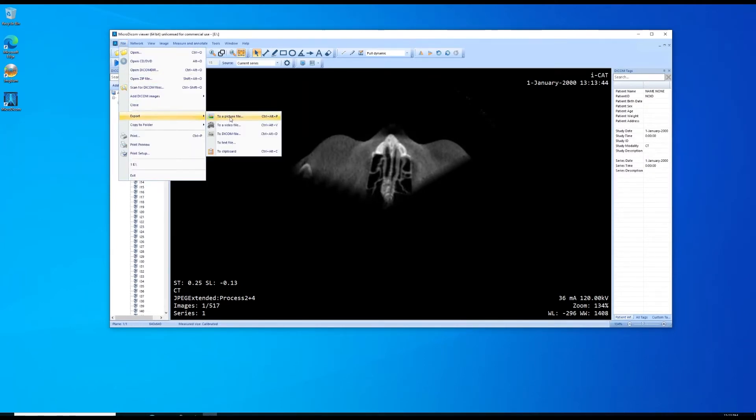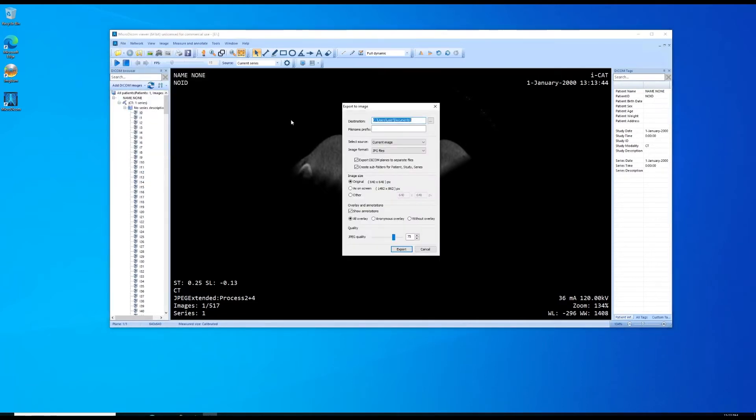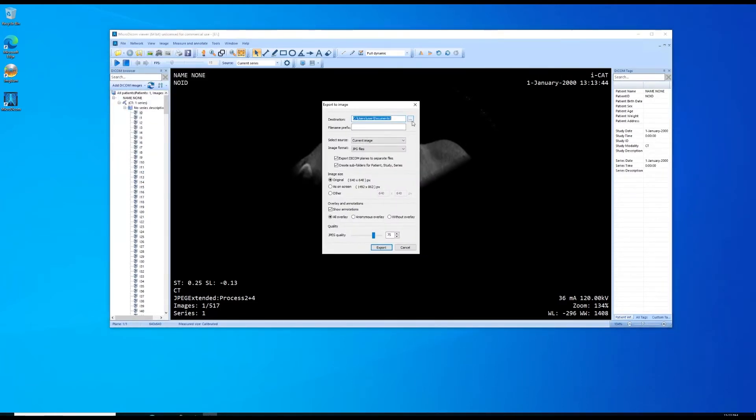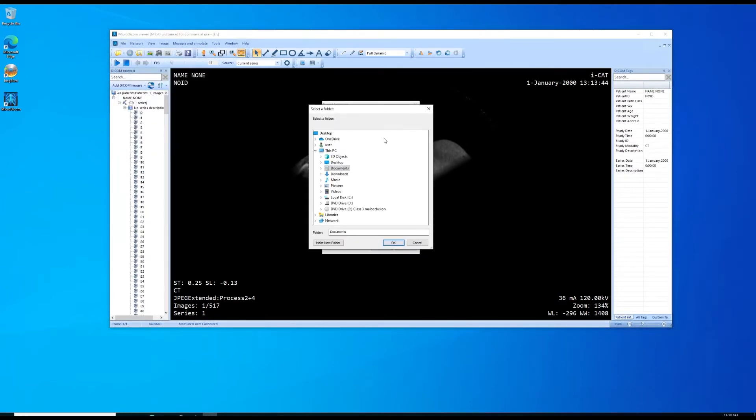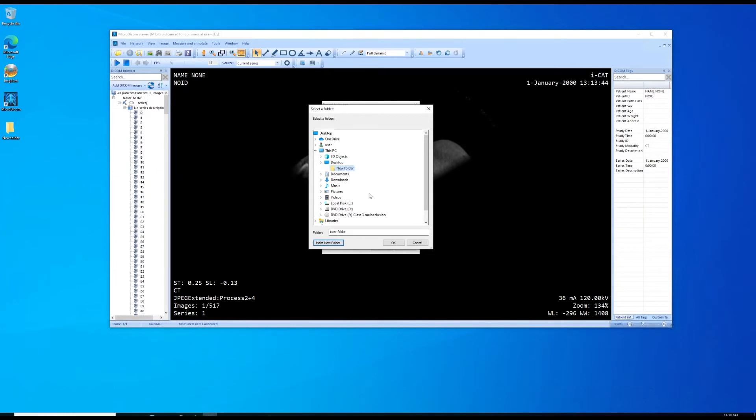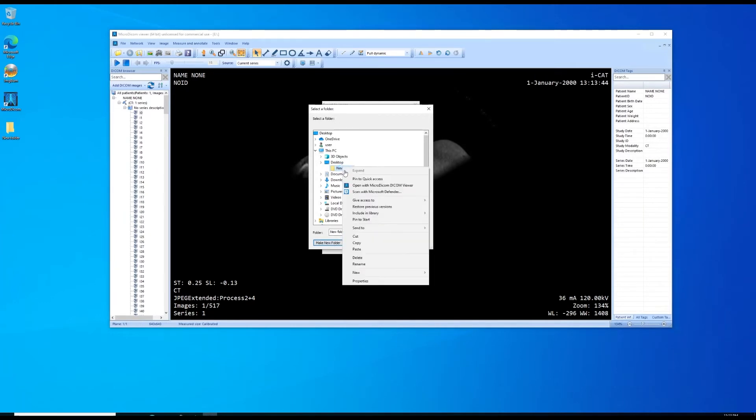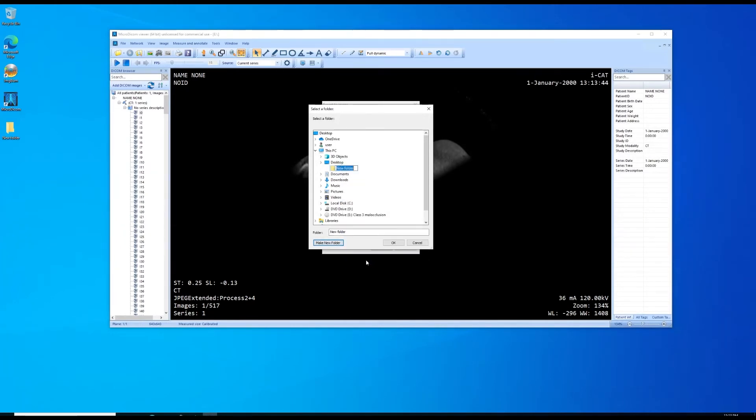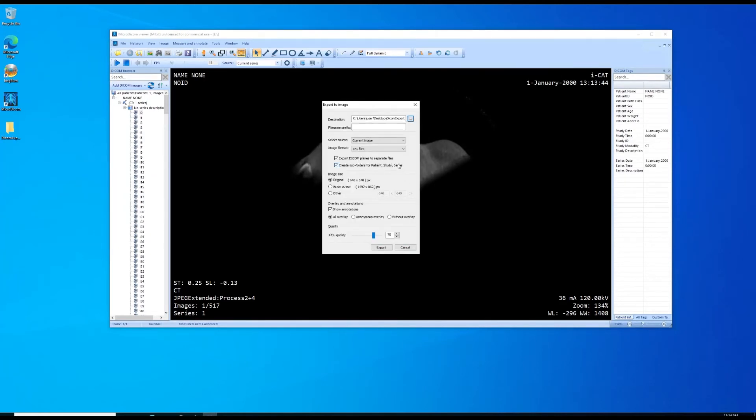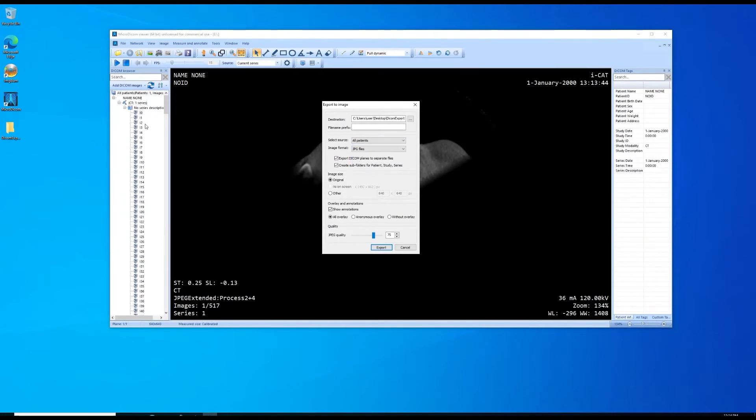We're going to file, export to JPEG. Here I'm selecting where I want to save it. I'm going to just throw these in a new folder. This is an anonymous test DICOM file so we don't have to worry about HIPAA data here. Leave that set the source to all patients. That's going to be the entire disk.